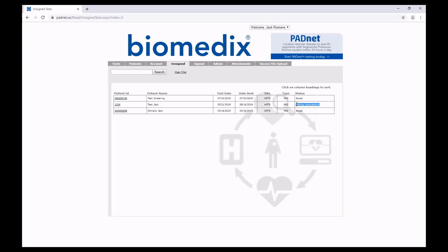If you have never engaged with the test before, it will say Waiting Interpretation. If you are in progress, you can see that it says Saved.